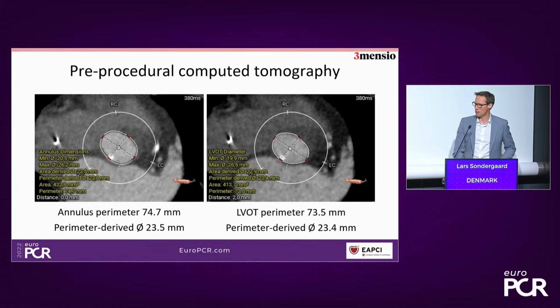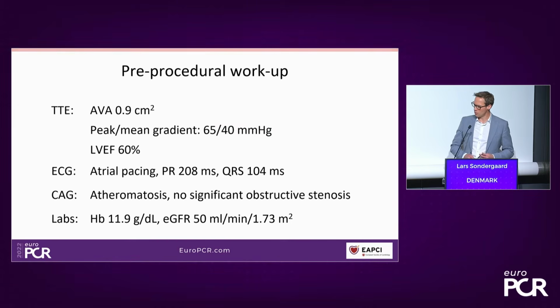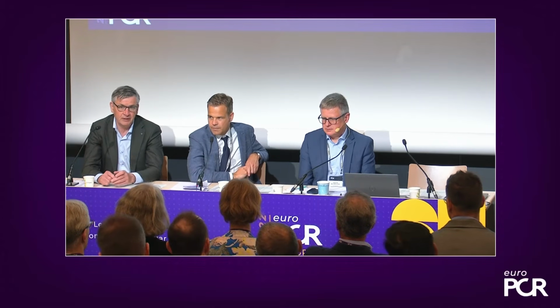So Lars, maybe before we get to those images that we're going to discuss, are you still doing invasive coronary angiograms, given that this is a non-invasive structural session? Yeah, so we do that even though there's been a constant discussion about skipping it. Start looking at the CT scan, because it's actually a coronary CT scan you get, so you can rule out whether the patient has any coronary artery disease. And if you do that, it may be half of the patients, or maybe even more, who don't need to have an invasive assessment for coronary artery disease. So it's certainly also information you get from your CT scan. You can streamline your procedures, save contrast and save resources, not doing an invasive assessment of the coronaries.